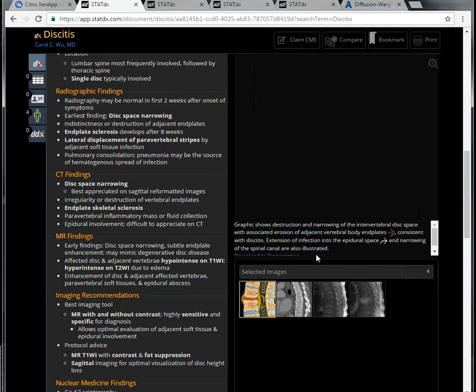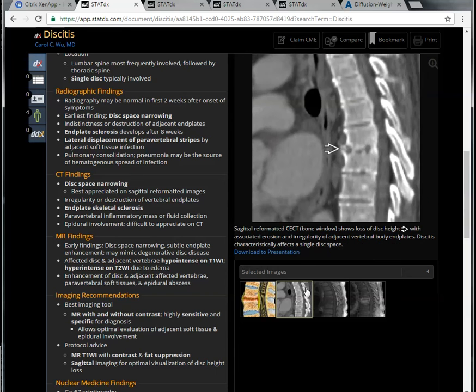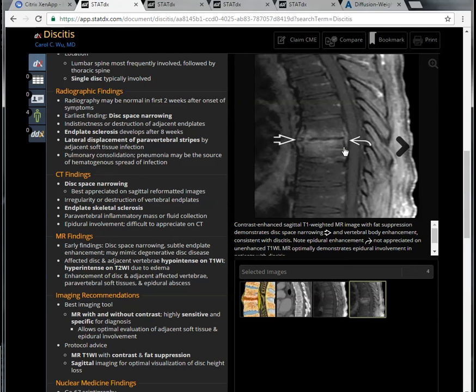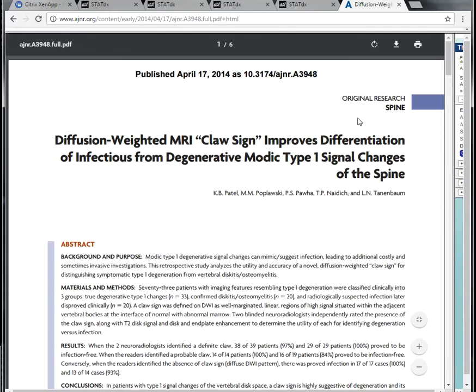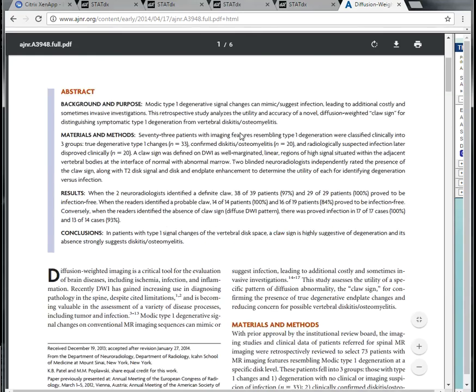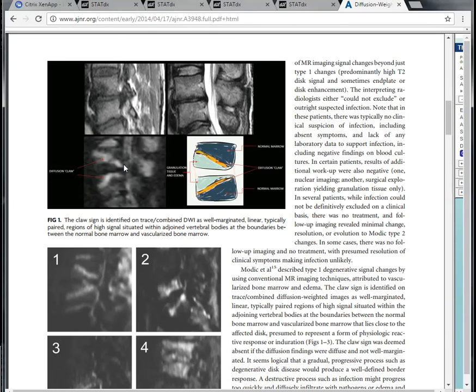Regarding disc involvement, the infection supposedly spreads to the disc, causing disc destruction, T1 hypointensity, and contrast enhancement. But this can sometimes look like Modic type 1 endplate changes where spinal instability arises. I want to reintroduce the help of the claw sign. This article is about diffusion-weighted MRI claw sign improving differentiation of infection from degenerative joint disease of the spine. If you don't have diffusion, you can use T2 fat-suppressed images as a guideline as well — it doesn't have to be diffusion.